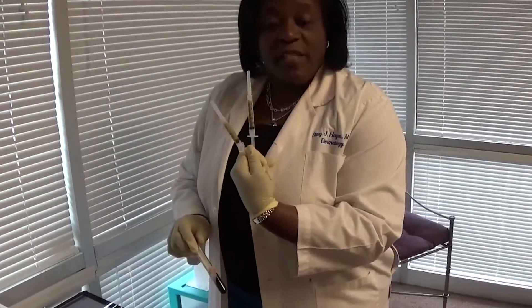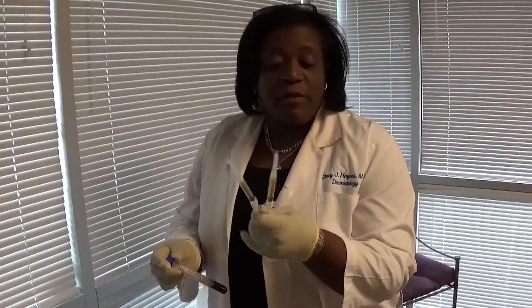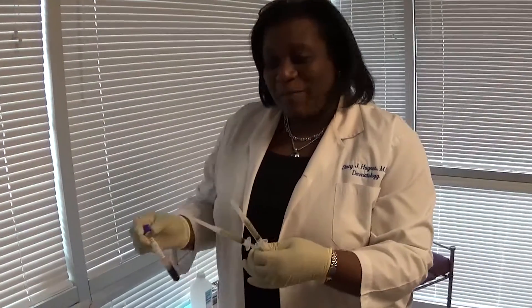Here's our PRP tube and you can see I used every last bit of it. I was able to get six cc's, which is pretty comparable to some of the other machines. So we've got a full six cc's to use on our patient.